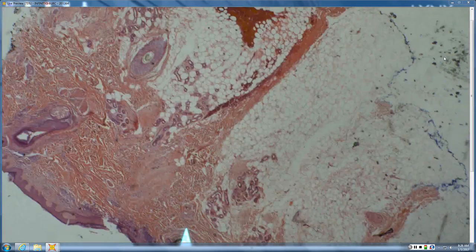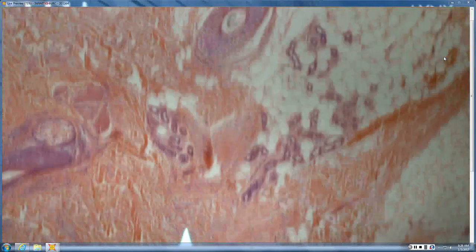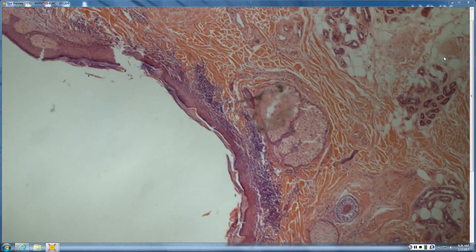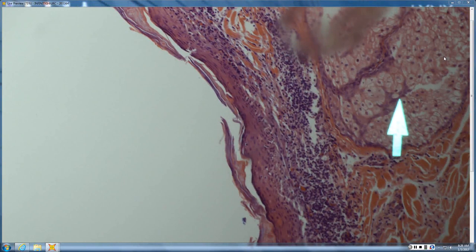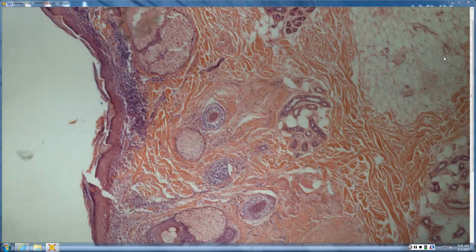I feel like there's kind of infiltrate around the epidermis. Yeah, it looks almost like it's lichenoid. With it being that high, you'd think of the possibility of lupus and LPP. What are the sebaceous glands weighing in there? Are they involved? They're retained pretty well, yeah. They're retained for sure.